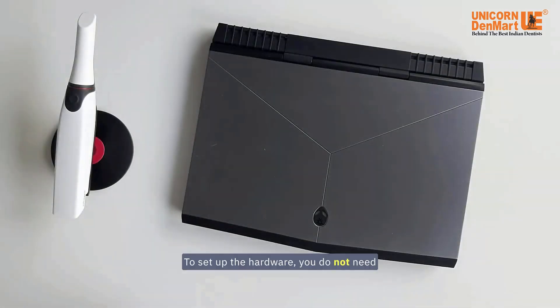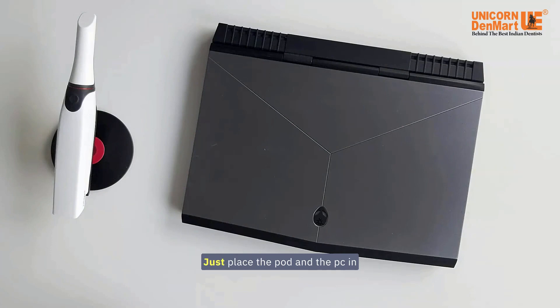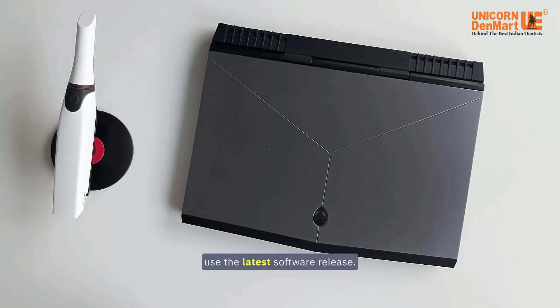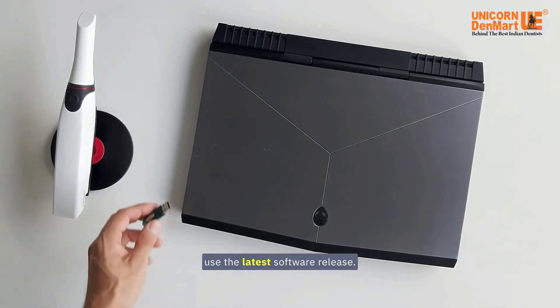To set up the hardware, you do not need any wires between the PC and the pod. Just place the pod and the PC in a place which is comfortable for your work. It is advised to always use the latest software release.